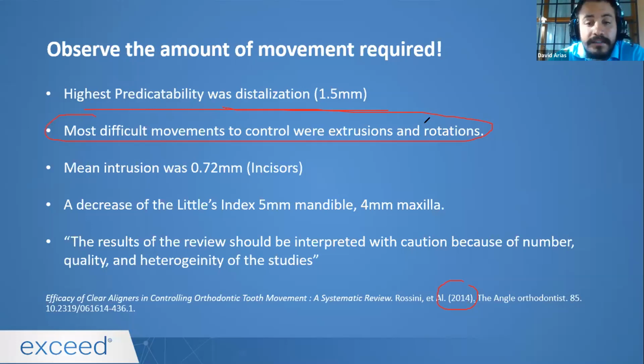Incisors, even canines, are not so difficult to rotate, because we have a surface that is actually not flat, but virtually flat. So we have places where we can push. We can just go ahead and program two forces, the couple of forces, to get a rotation. But if you have a premolar, for example, and you go in here and in here to try to make a rotation, sometimes we don't have enough surface area where we can push. So it is in these situations that we can still make rotations of premolars, but we might need to use attachments. Imagine this is from the occlusal view, right?